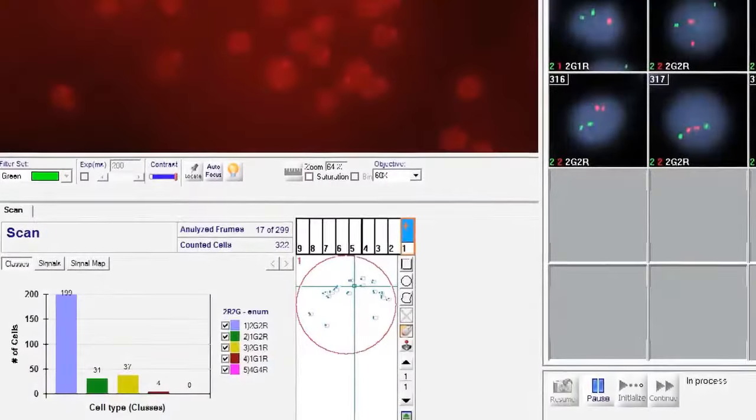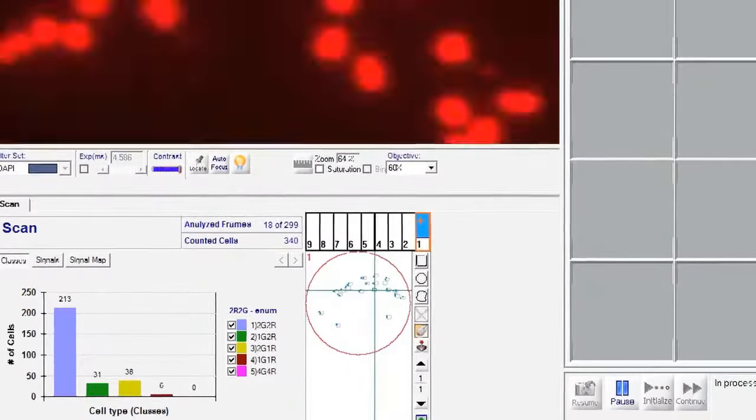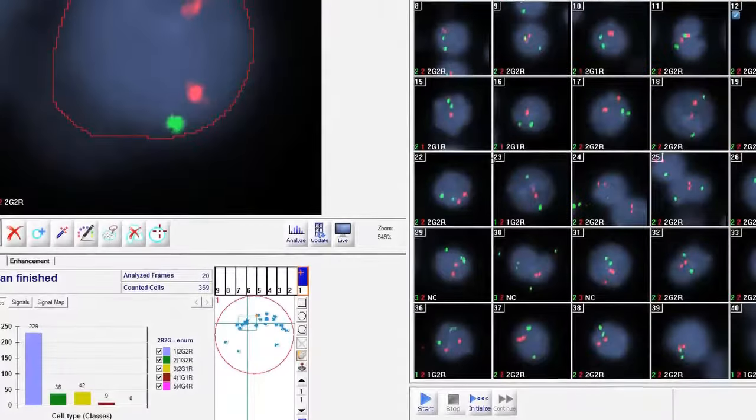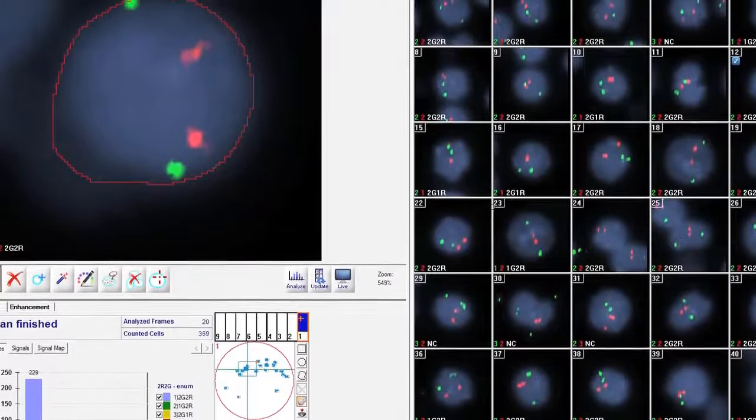Statistics are automatically updated and cells are displayed in an image gallery according to predefined class definitions. Unexpected aberrations are automatically identified for reliable and efficient review.